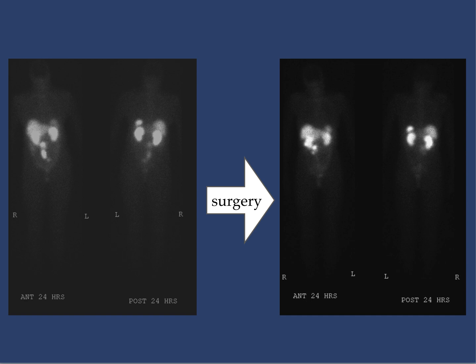And we can see that it's used pre and after surgery, so we can see the lesions after surgery. We can see fewer, but not the entire excision of all of the lesions after surgery.